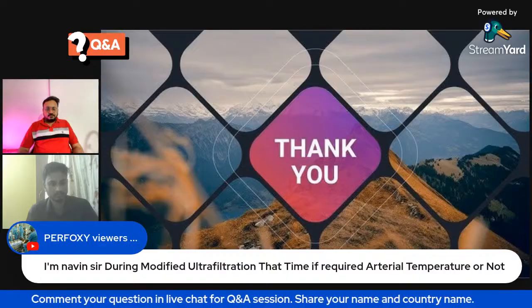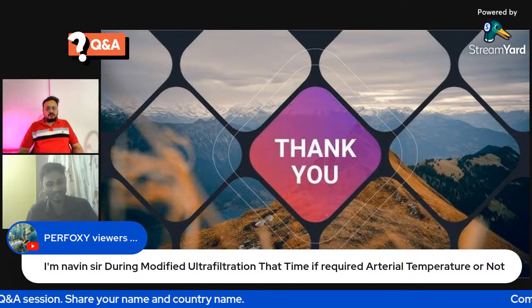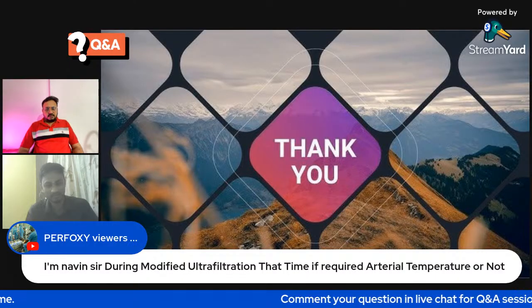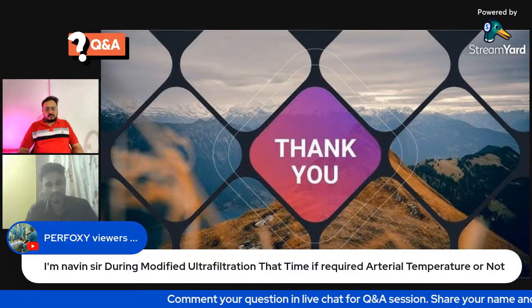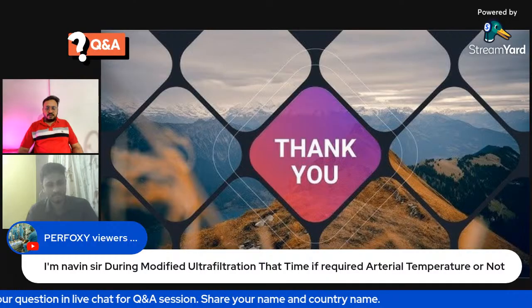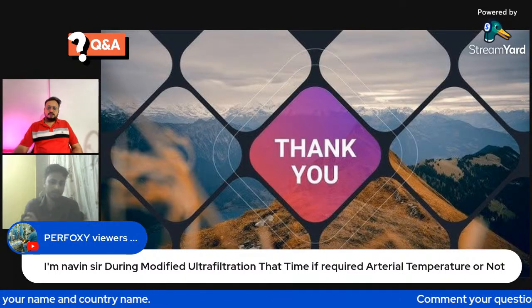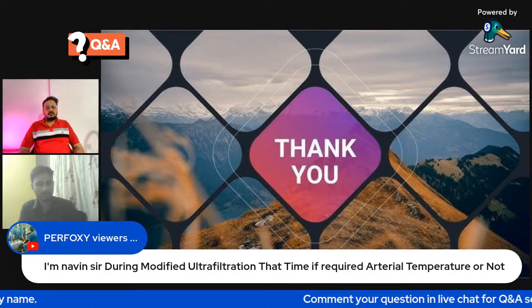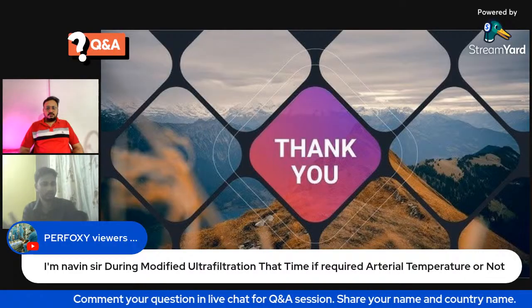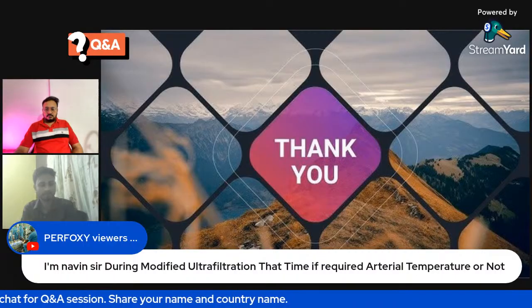Okay. We have one more question. It's from Naveen. He's from India. During modified ultrafiltration, is arterial temperature required or not? It is not required, because MUF is done after rewarming, only after post CPB. Temperature is not required.